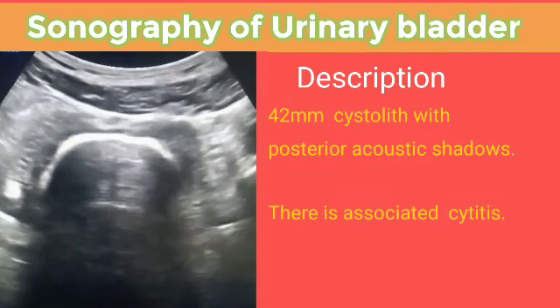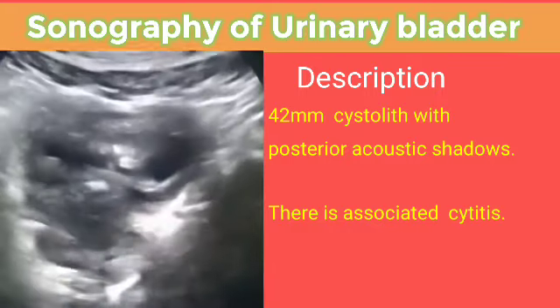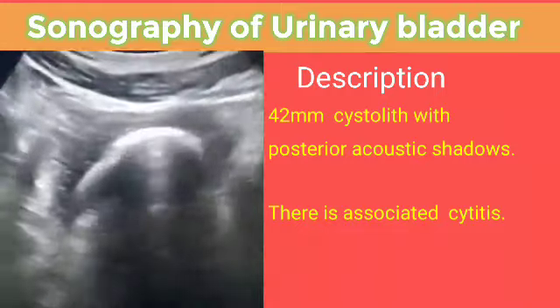This is another huge urinary bladder calculus with posterior acoustic shadows. The urinary bladder wall is also thickened, so there is associated cystitis. You can appreciate the size of the urinary bladder calculus. Here is the video demonstrating the huge urinary bladder calculus.